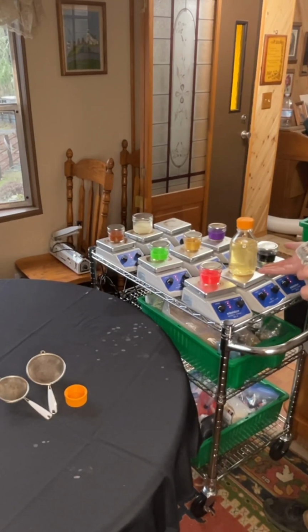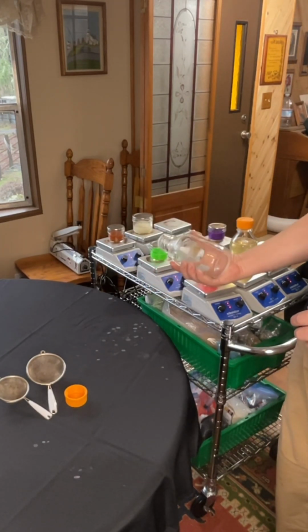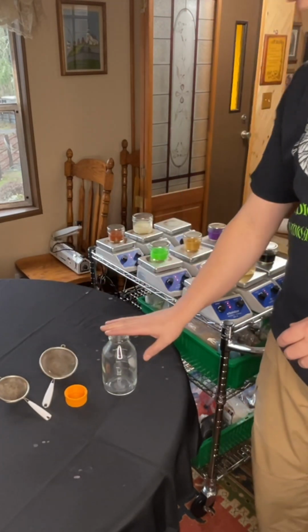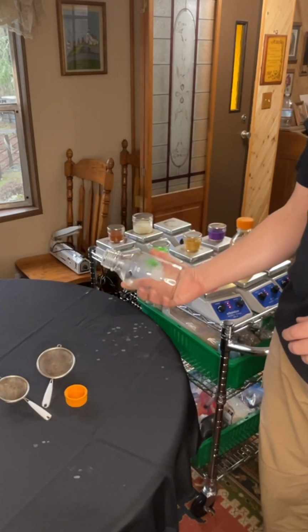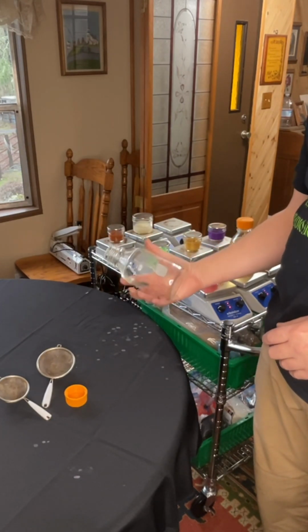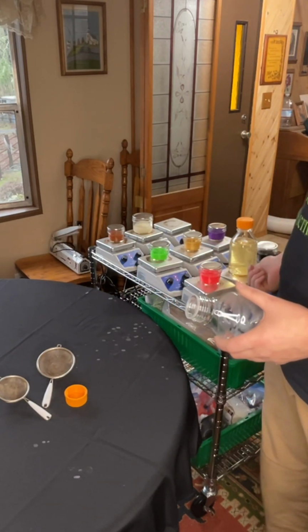Alright, so here we are. You can see our Gellan gum here has cleared up pretty nicely. We do still have some chunks batting around in there, so we're going to take our media bottle here to transfer it into. We're going to use our little tea strainers here, and we're going to get it in this bottle. Initially what I did is I put this in the microwave for about 30 to 45 seconds. It heated it up, and it'll keep it from breaking when I pour this really hot liquid in here.